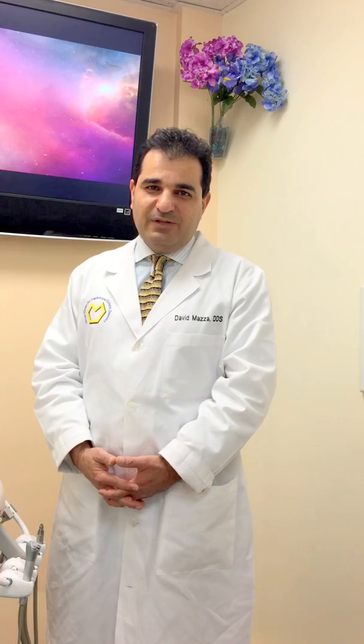Hello, this is Dr. David Mazza, and today I just wanted to demonstrate how to establish one of the compensating curves, which is the curve of Spee, on the SAM III articulator.